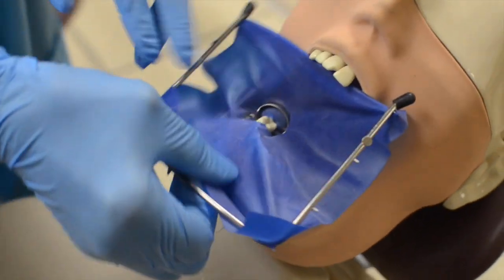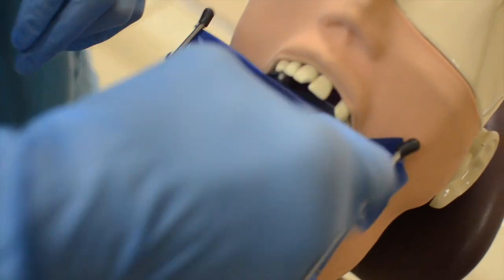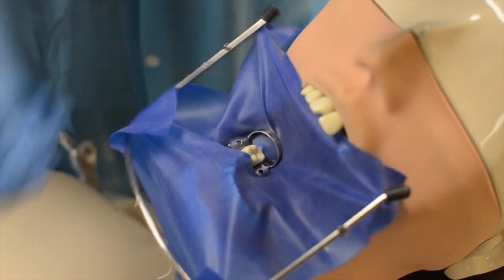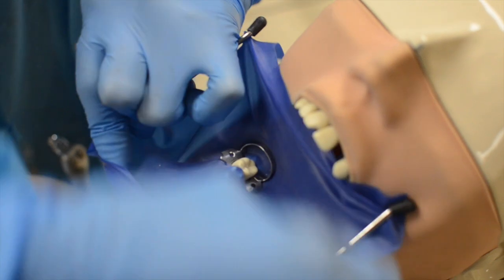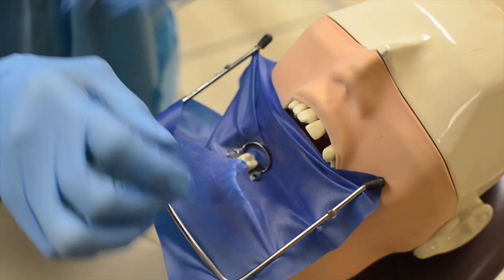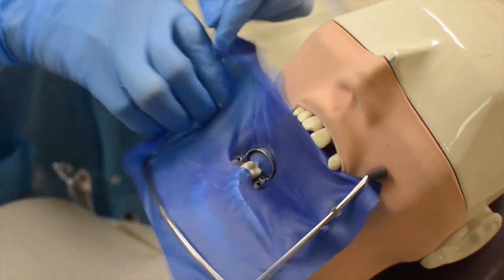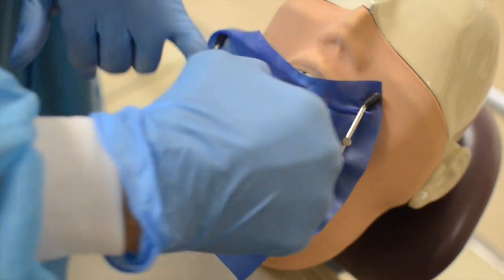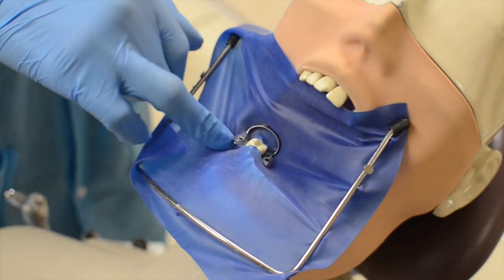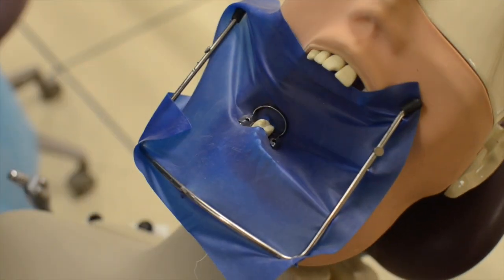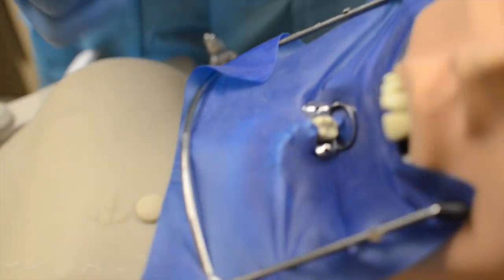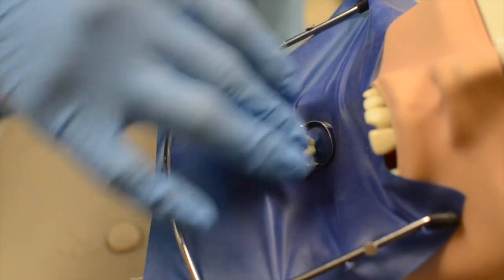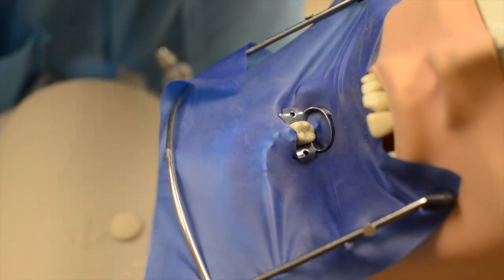The benefit is that you can see easily, you don't have anything in the way. If you were just doing one tooth in that dental visit, and it was a class one, you really wouldn't need to isolate the entire quadrant. You just don't need to. And this is quick and simple. The rubber dam is underneath the holes already. So there's not going to be any saliva popping up. If you wanted to isolate more teeth, that's fine. The benefit of that is it helps with vision. You've got a nice finger rest available.